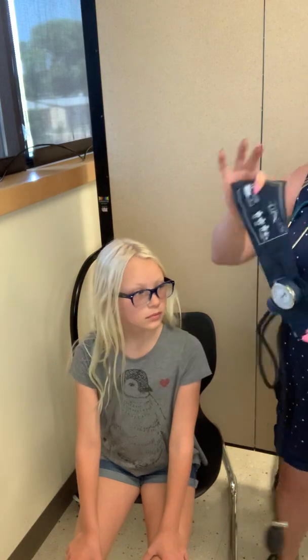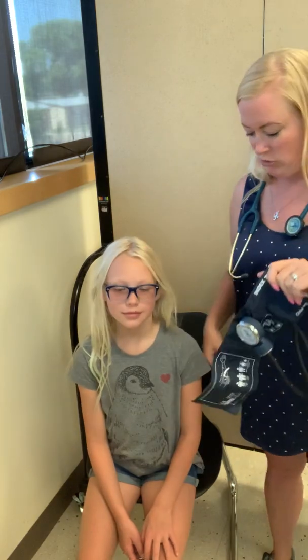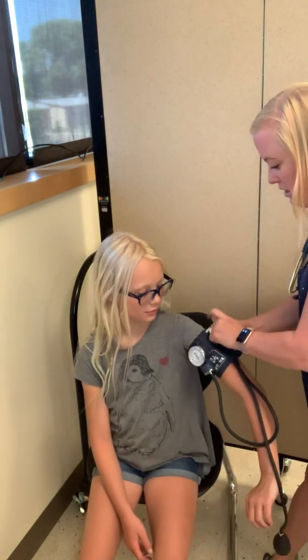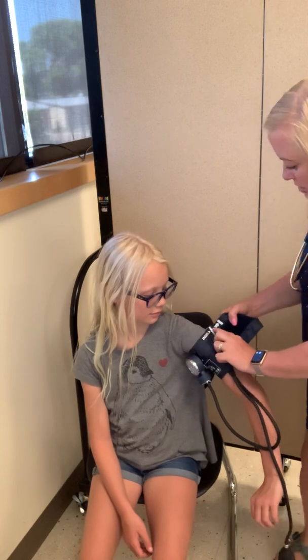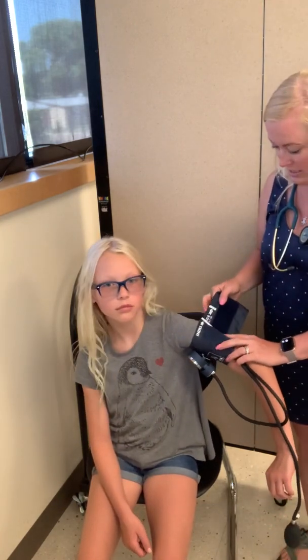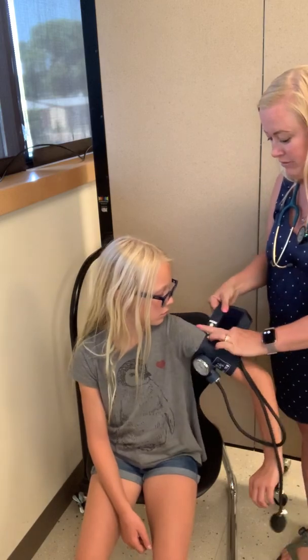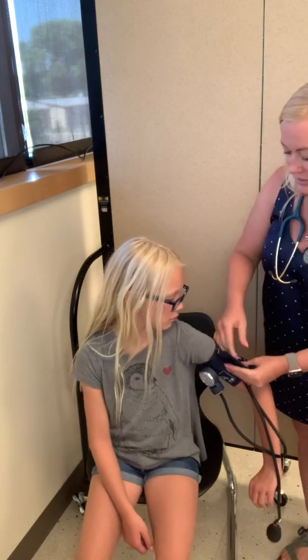So first thing we want to do also is to make sure that we have the appropriate size blood pressure cuff, which is the pediatric version here because she is a little tiny little thing. So I'm going to place this firmly over her upper arm and I want to make sure that this line here is in between this line and this line on the back side of the blood pressure cuff. So I'm going to make sure that it's tight, but it's not too tight, but it's snug.